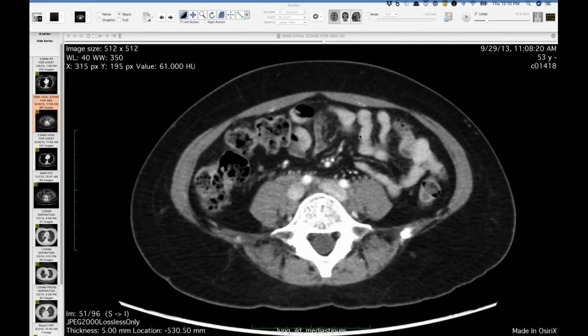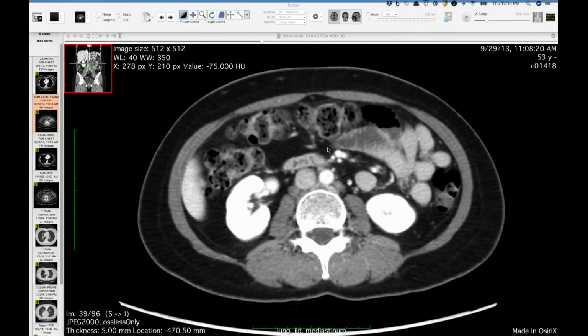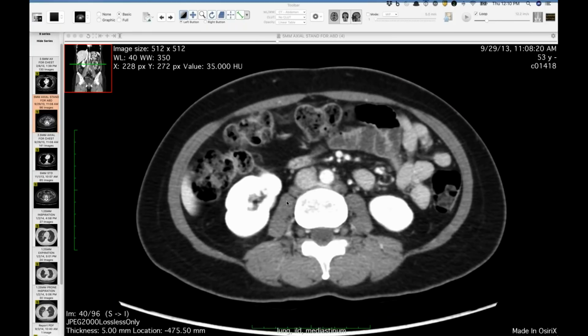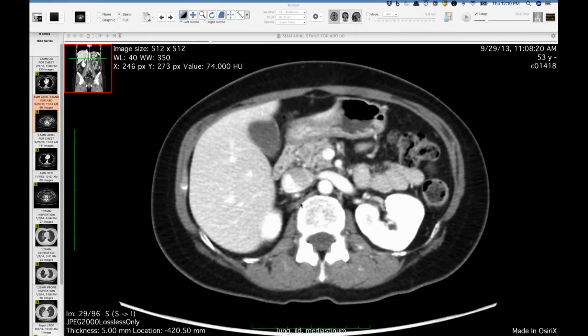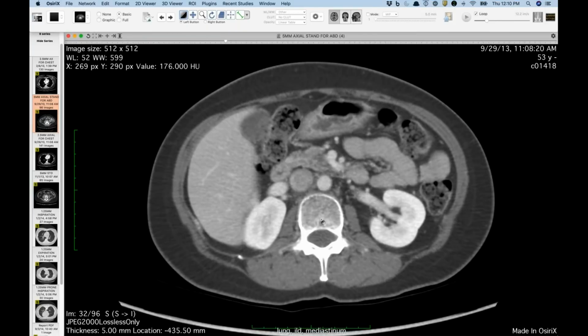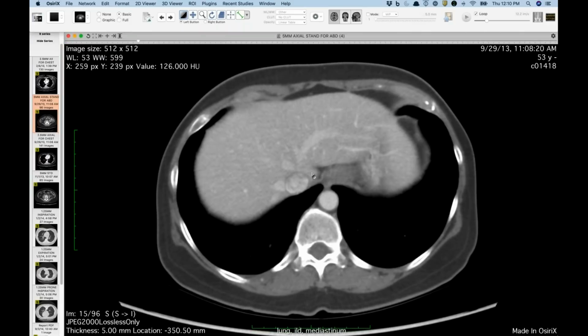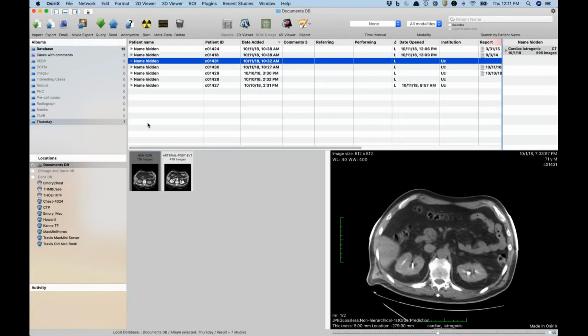Yeah. Okay. I've seen them in the upper retroperitoneum on chest CTs in patients with LAM and tuberous sclerosis. So along the aorta, periaortic, and stuff like that. Yeah, there's probably some small ones here too, but that's one thing that we just so infrequently encounter. I don't think to look for those as much as I think to look for the AMLs in the kidneys and the fatty foci in the heart, et cetera. All right, let's see.